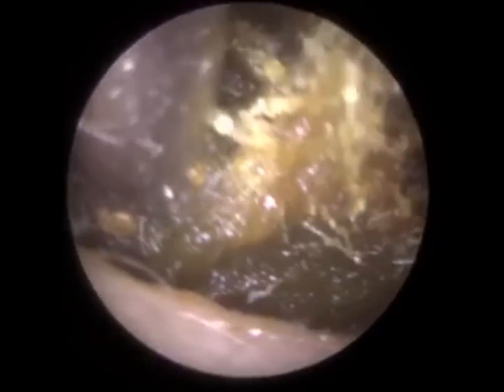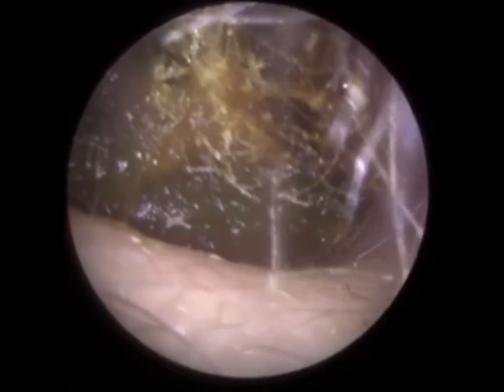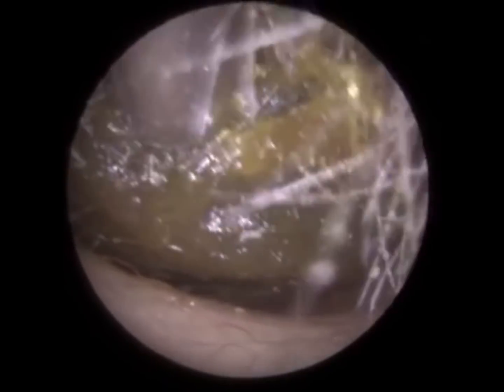You can't see it's lodged, but it is extending towards the eardrum, and when you're manipulating the wax with the Zollner suction probe, you can feel that it's just lodged a bit deeper in the ear. You get that kinesthetic feeling. So I'm just trying to loosen it, and you'll see I'm just wriggling here in round circles just to dislodge the wax. I think at this point I've dislodged it. You can see there's a lot more movement now of the wax.